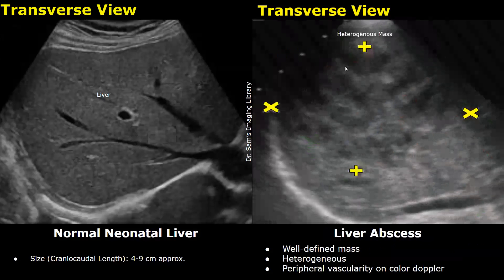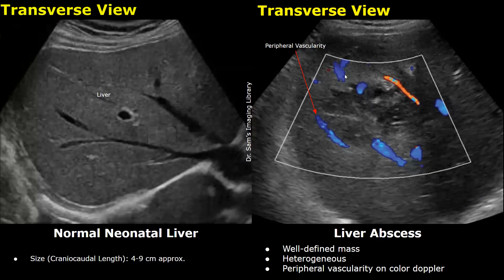A liver abscess usually appears as a well-defined heterogeneous mass. On color Doppler, peripheral vascularity will be seen — we can see vascularity at the border of the mass. These features of a well-defined heterogeneous mass with peripheral vascularity are usually seen in a liver abscess.